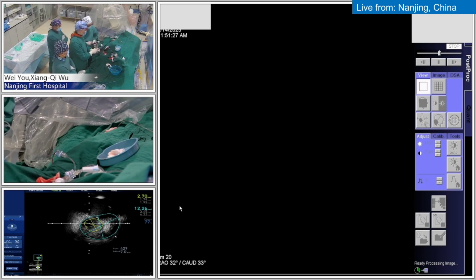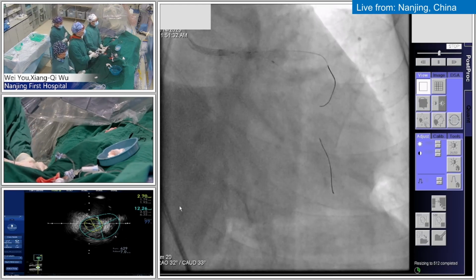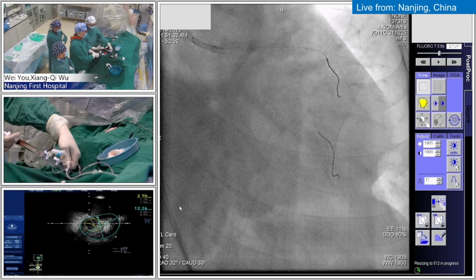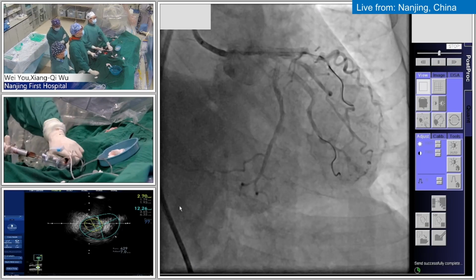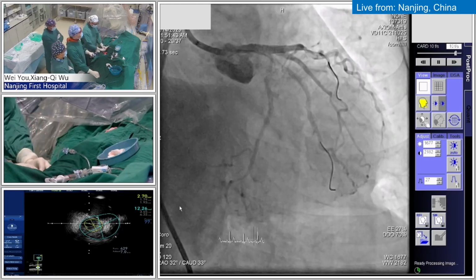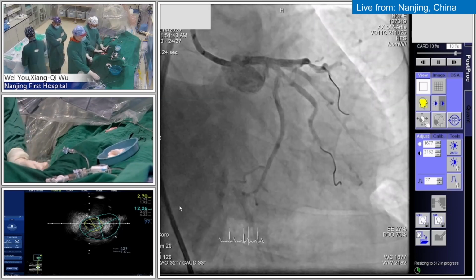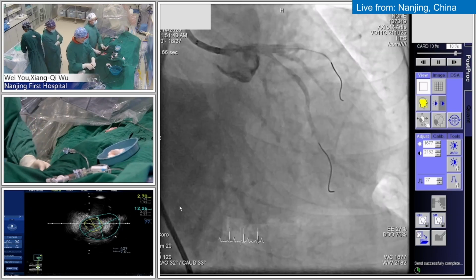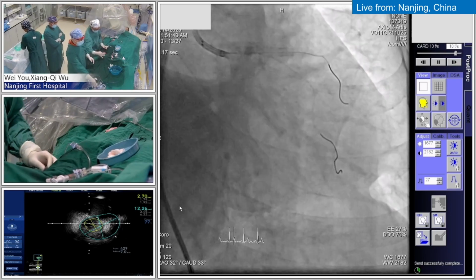And I'd like you to focus on this aspect where I'm mentioning the strategy which we have used at Medstream 360 to avoid excessive moderation. And I cite to you the case which was performed by Dr. Hung, and I think it's Dr. Robert at Montreal Heart Institute. This was the case of the week from last week, where they had a highly complex dissected and compromised left main, and in a most unrushed collaborative fashion, the management of this lesion was performed.